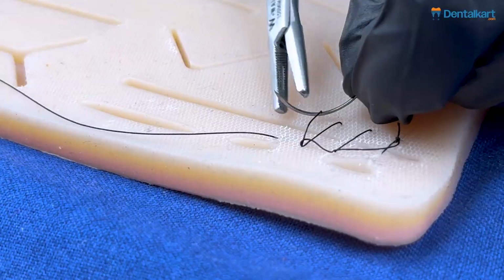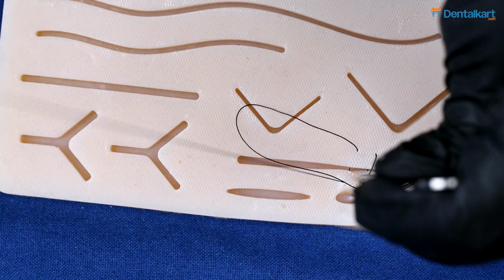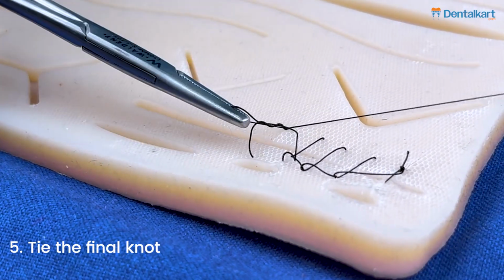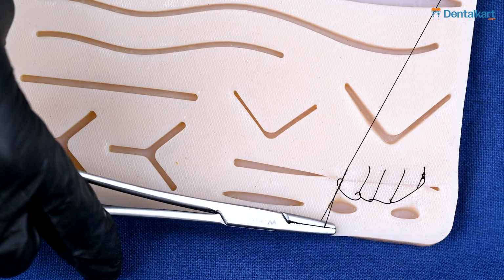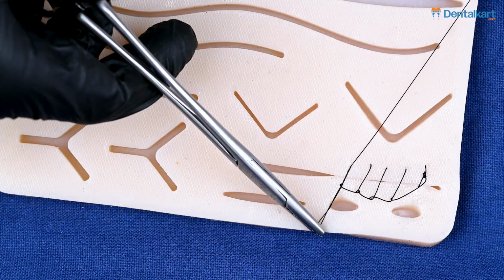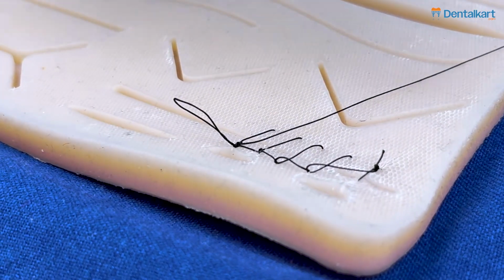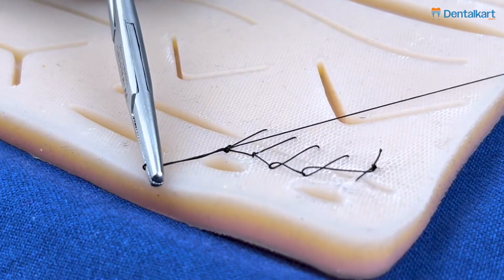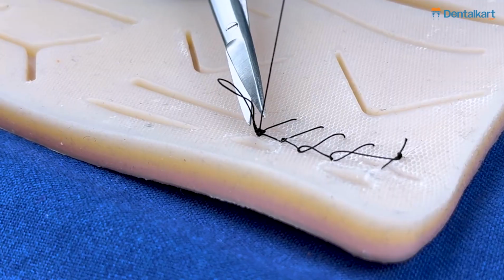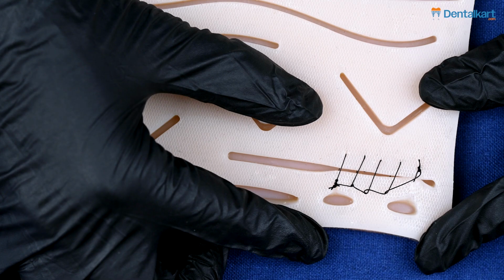This is going to create a series of locks, which is important. And as the name suggests, this is how we create a continuous locked suturing.